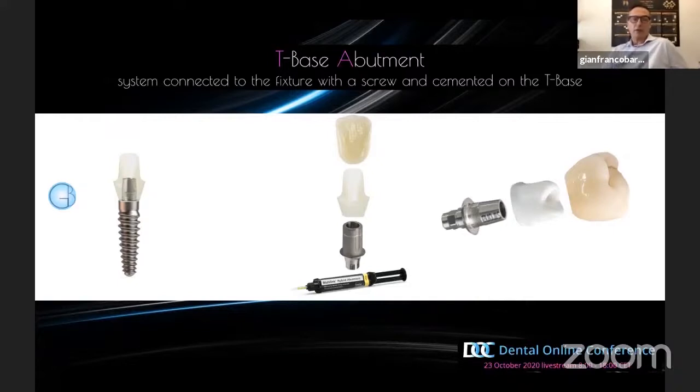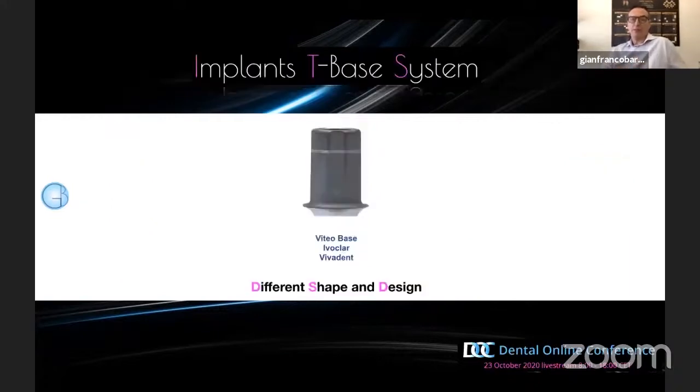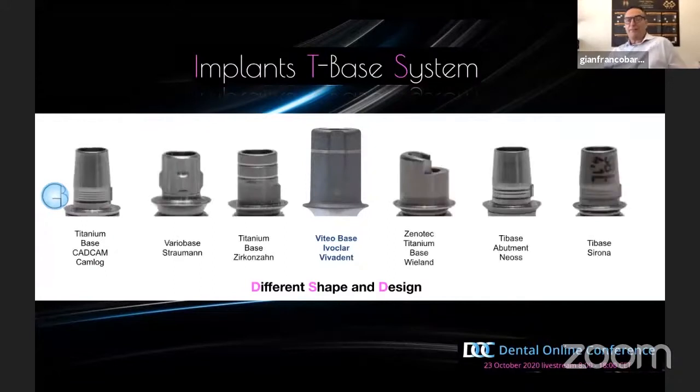The connection between the post or crown, the monolithic crown, is done by cement. The cement is a resin cement that gives us a strong connection between the two pieces. There are a lot of T-bases on the market made in different shapes and with different designs.